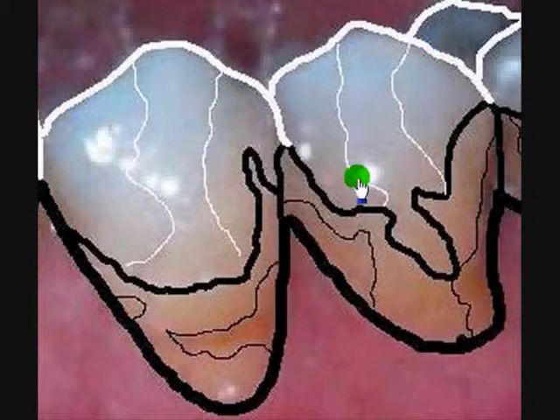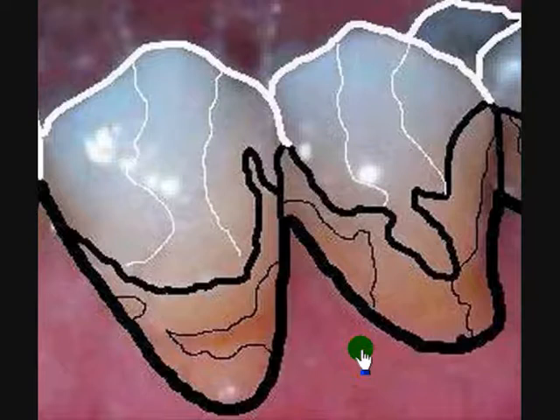But you see, through the mapping, I am able to already print in my mind how colors and shades need to be located and collocated during the build-up phase of the job.